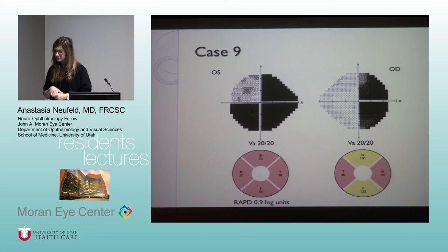So it's either imaging or some other ancillary testing we can talk about later that can help you distinguish where exactly it is. But there's some help here. Let's talk about this visual field deficit, which is an inferior temporal on the left, right? What could this be? What pattern could this be associated with? If you look at this and you look at that, what could be hiding behind this homonymous field? A bitemporal, very good. But also if you just isolate the left eye and look at that, what would this give you an idea of?